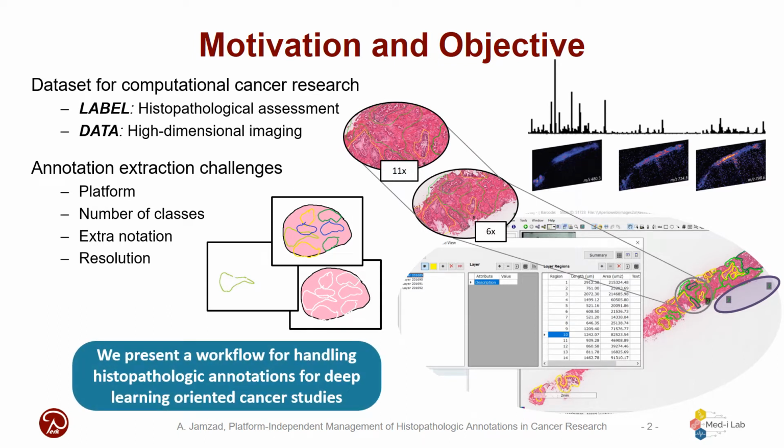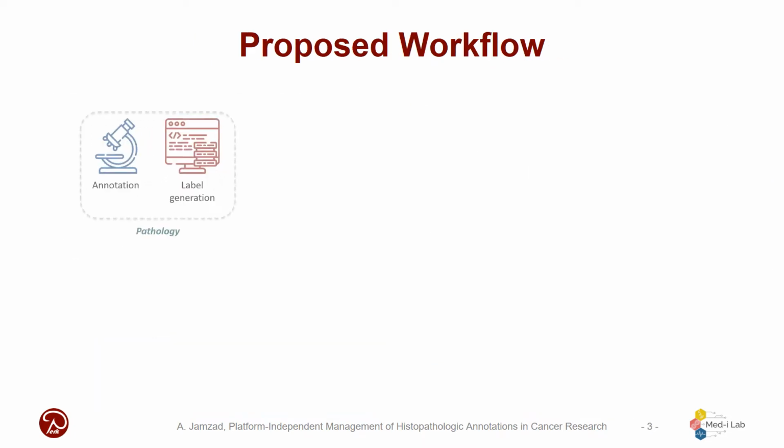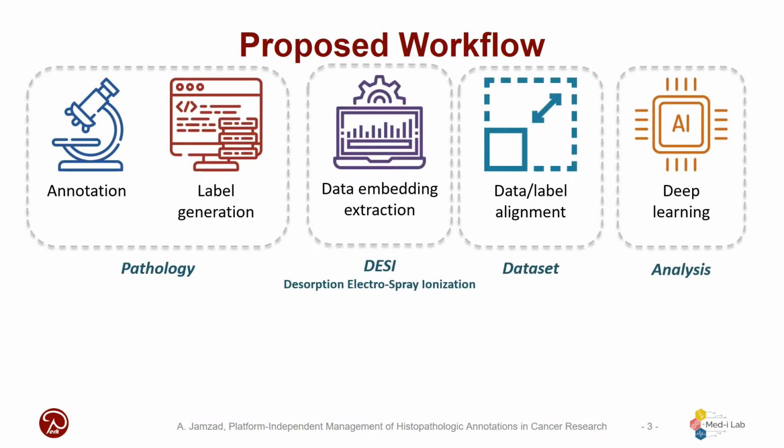Here, we propose a workflow for handling histopathologic annotations, which is compatible with the standard platforms and addresses these challenges. The proposed method includes label extraction, tissue localization, dataset generation, and validation through a deep model.